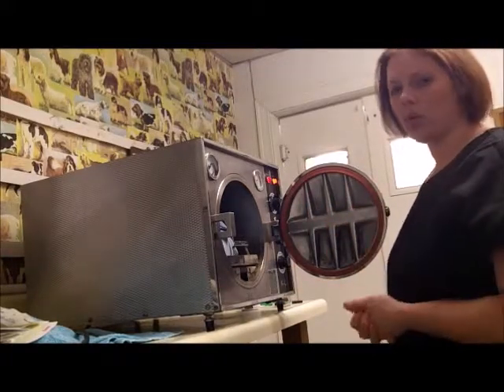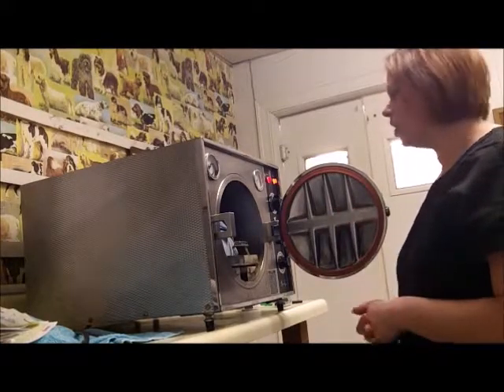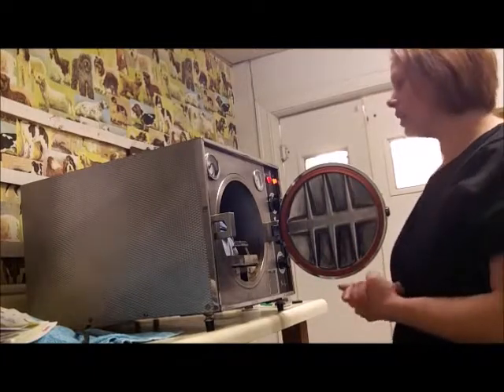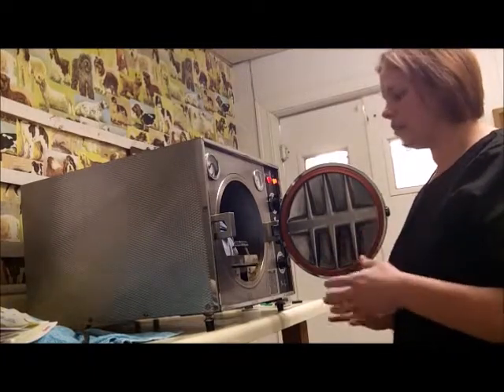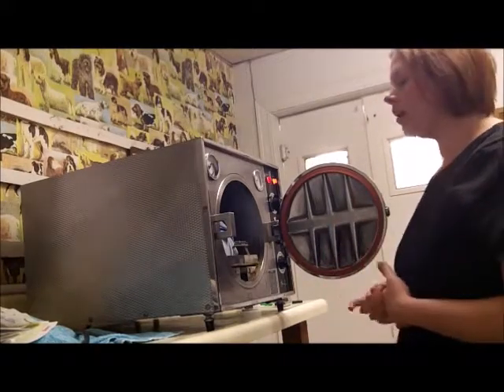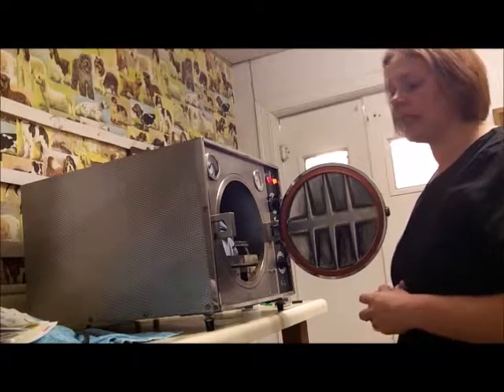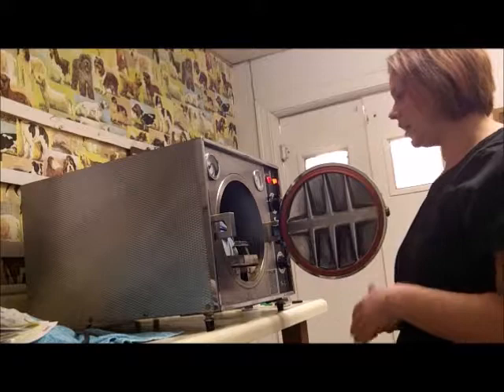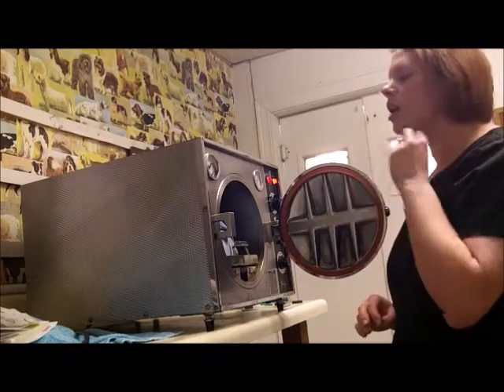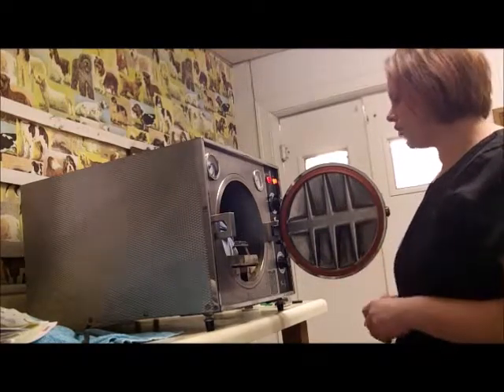It usually takes about 20 minutes for this machine to get to the proper pressure and the proper temperature. Proper temperature is around 260 to 270 degrees. Once it has reached its proper temperature, we will let it sit at that temperature for about 20 minutes. After the 20 minutes of steam sterilization, we will vent the machine. The venting releases the pressure, and then we'll open the door to cool down the temperature once we've turned it off, and then check for sterilization.